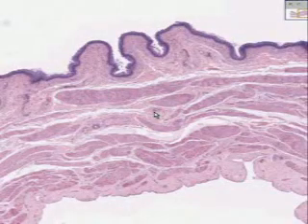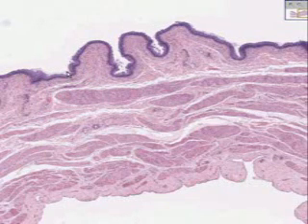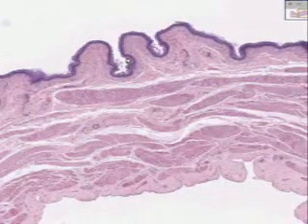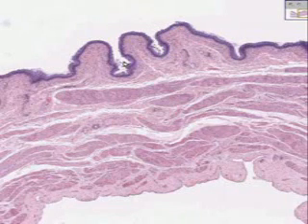And here is the most beautiful bladder you will ever see. Notice, like in many of the things we have been discussing, the mucosal cells are basically bluer, chiefly nuclei and cytoplasm, and no connective tissue, which is why they look bluer than the underlying connective tissues. Notice it has kind of an undulating or wavy appearance, certainly not really papillary.